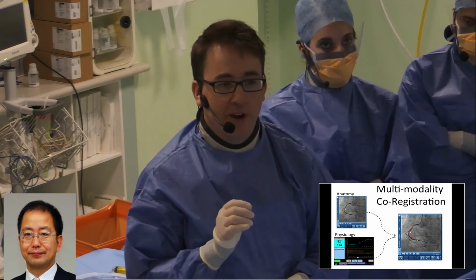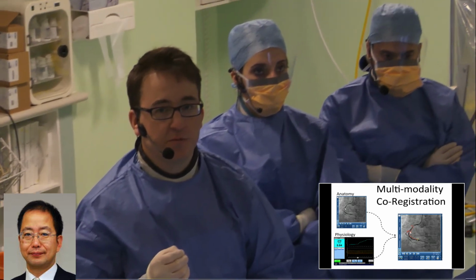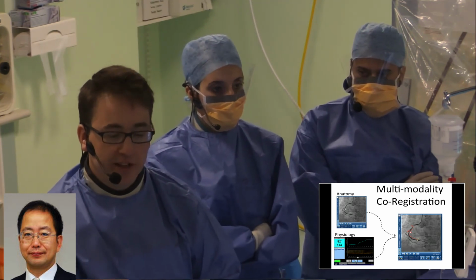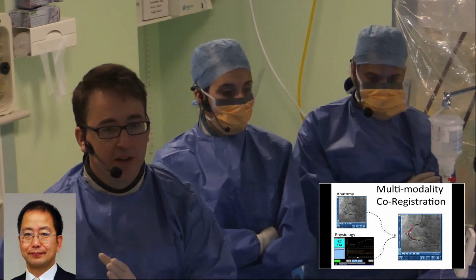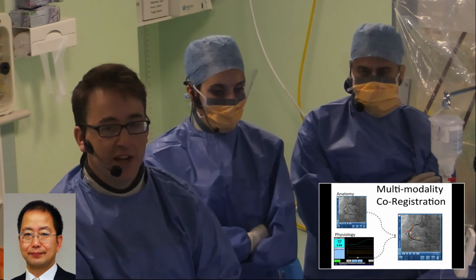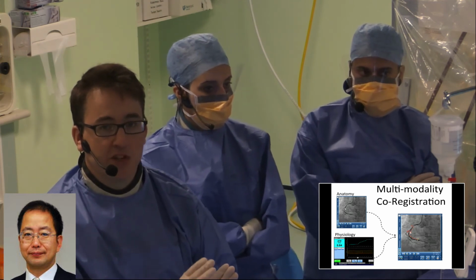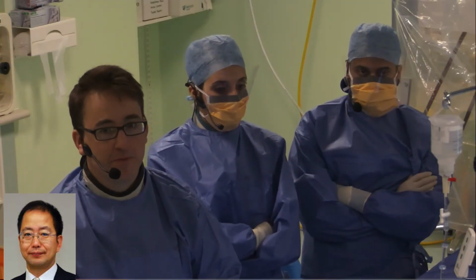But in reality, I would recommend not worrying about it, because people are very used to pulling back at that speed normally. So it's just a normal slow pullback, and don't be worried about the time. The most important thing is that they start the pullback and continue all the way up to the left main stem in one constant motion. That's the key thing. No stopping or starting, just start distally and continue all the way back up to the main stem. This way the system can best calculate where the step-ups are, and it makes things work very, very smoothly and simply.